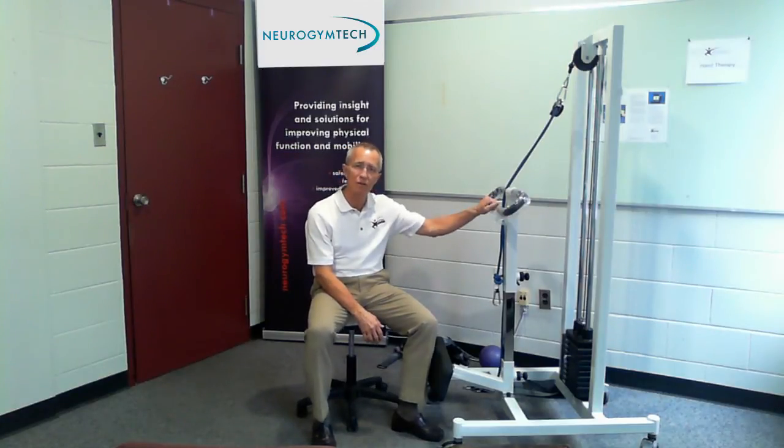My name is Kevin Mansfield and our company is called Neurogym Technologies. We manufacture a line of mobility enabling tools for people with movement disorders. The tools enable training with all aspects of mobility — strength, balance, and coordination. Today is an instructional video on one of those pieces of equipment called the sit-to-stand trainer.